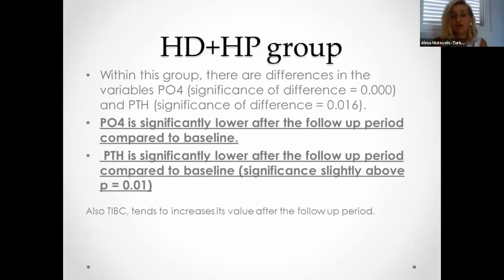So, when I showed you our result, we can conclude that after receiving this hemoperfusion treatment, our patient had an improvement in our laboratory data. The improvement in the laboratory data gives an improvement in their clinical characteristic, and therefore it gives them an improvement in their quality of life.